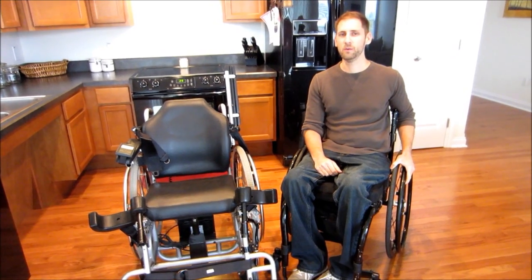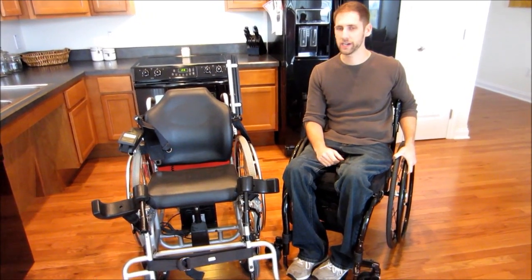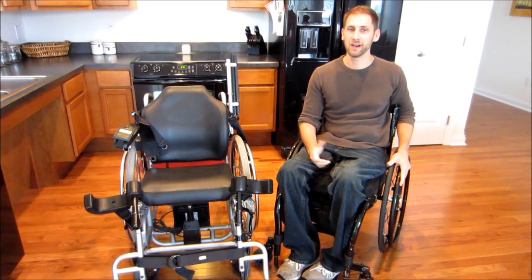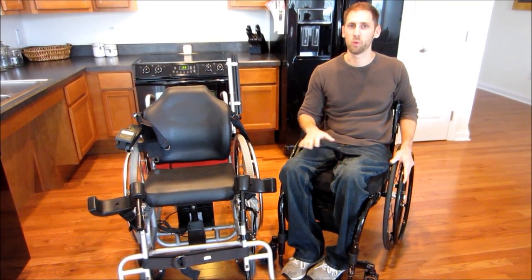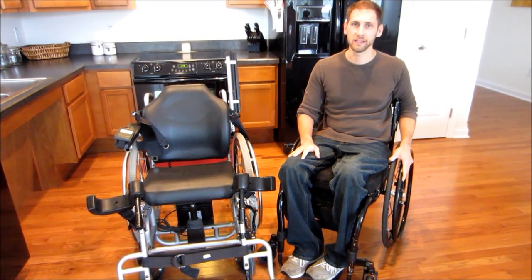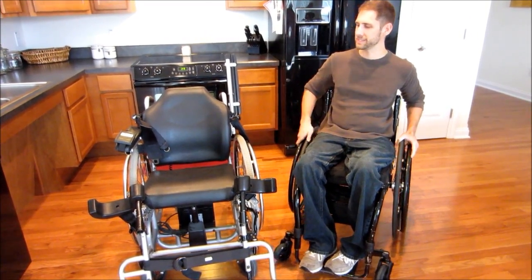Hey guys, today I want to talk a little bit about my standing wheelchair. Obviously, you know that if you are paralyzed, it's a really good thing to get some weight bearing on your legs. The best way to do that is obviously to stand. This is my standing wheelchair.